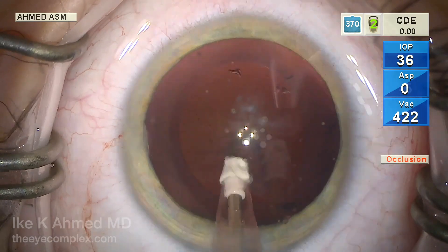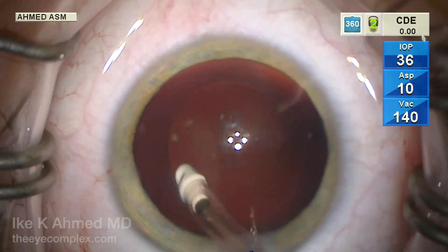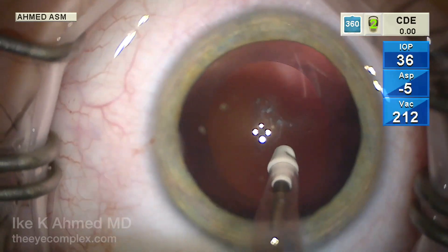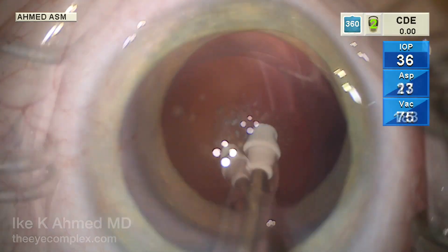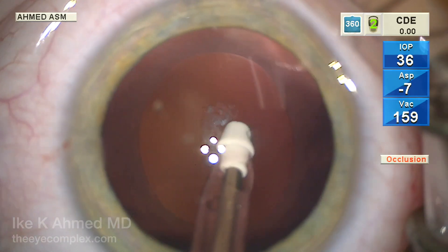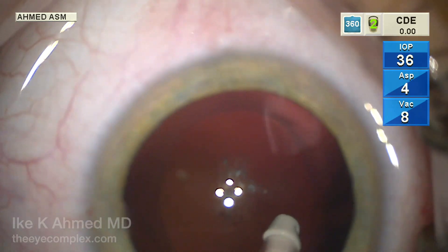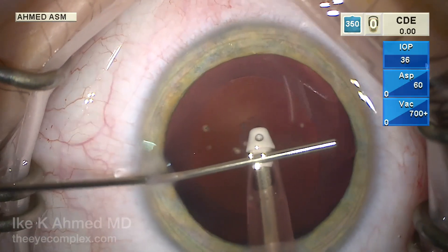There is a posterior opacity present here. We'll polish the capsule very carefully, as these capsules can sometimes be thinner than normal. Just polishing that peripheral capsule here is important, as you'll see later, to reduce those cells that potentially proliferate onto the posterior side of the lens.